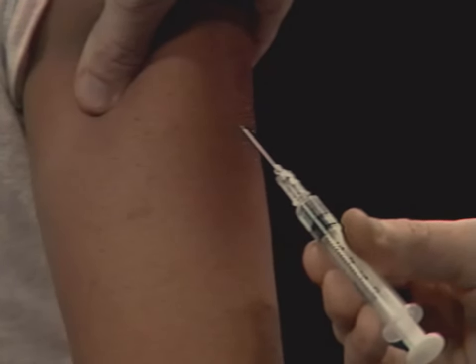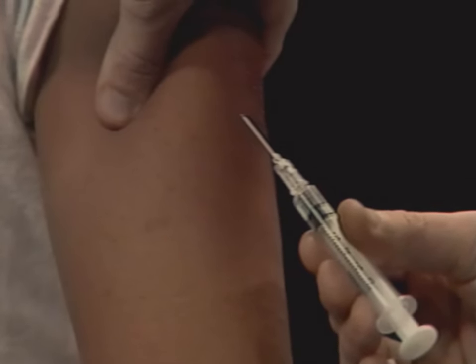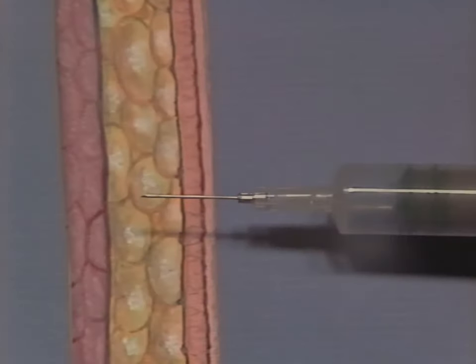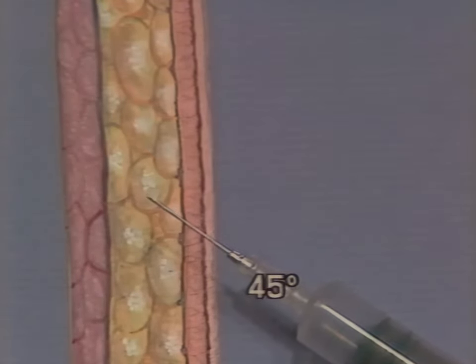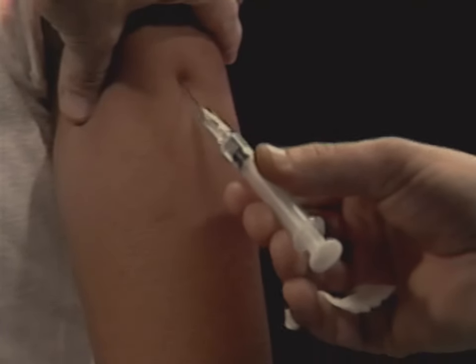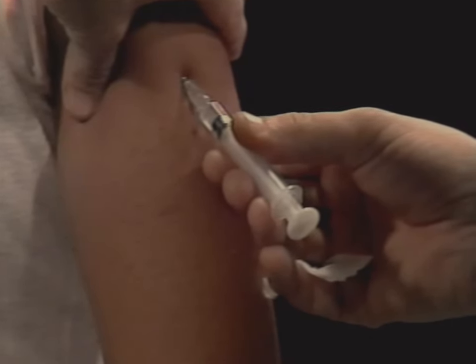Now move the needle up toward the cushion of skin you're pinching between your fingers. Hold the needle at about a 45 degree angle upwards — straight in is 90 degrees, 45 degrees is halfway. Insert the needle at this 45 degree angle into the skin with a firm, quick forward thrust.